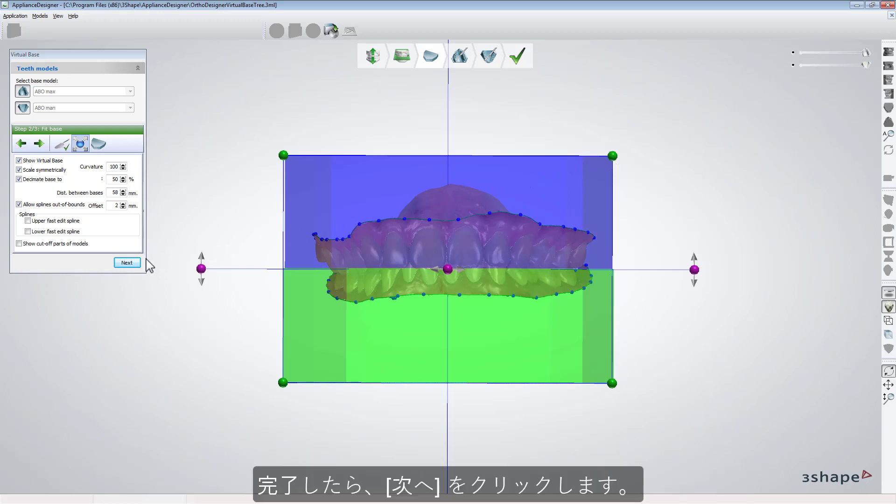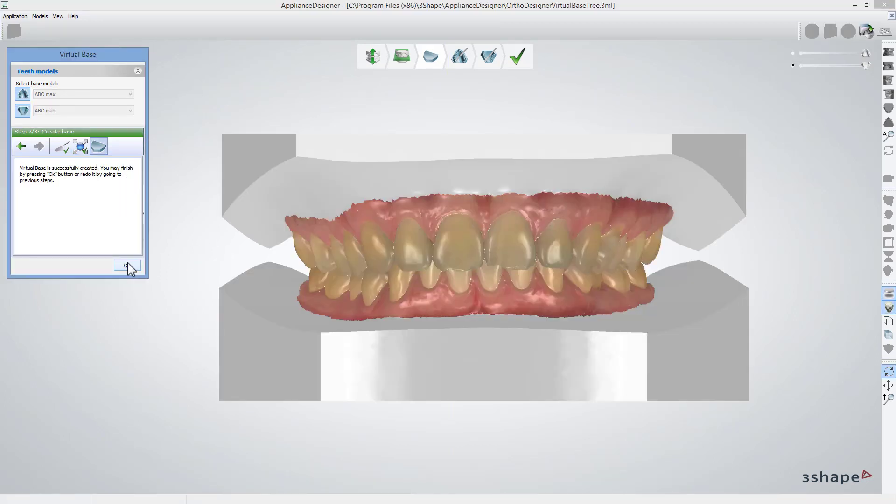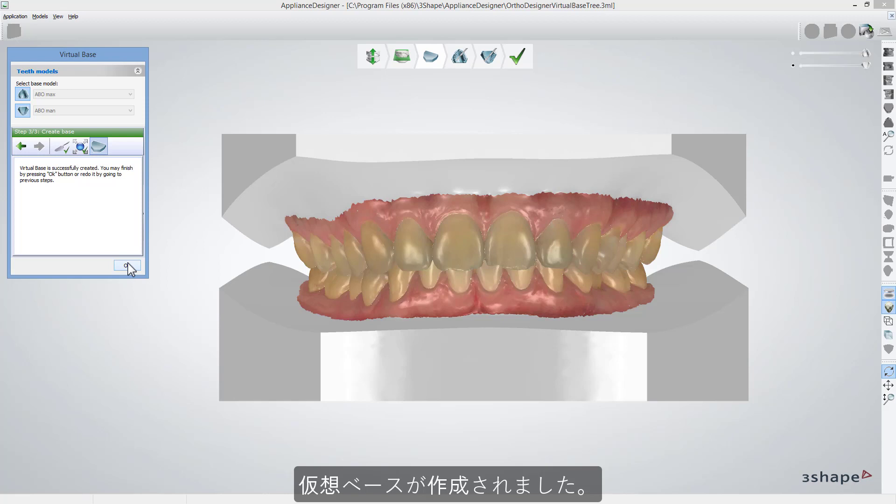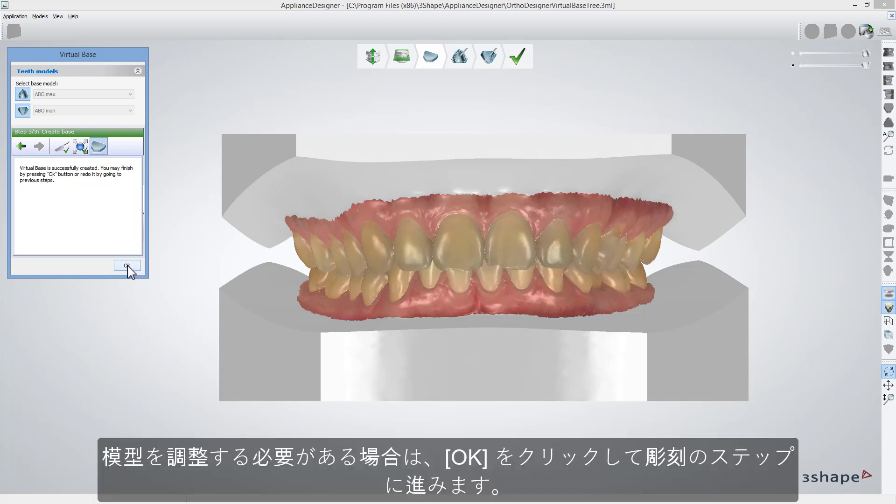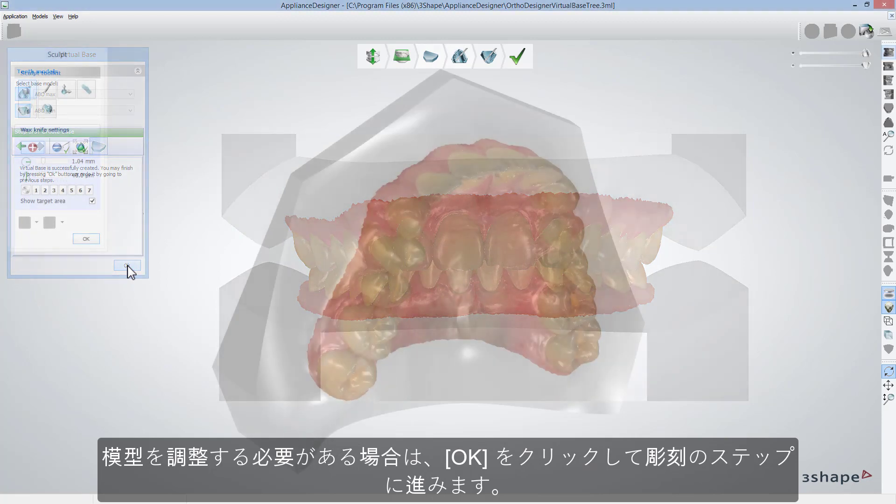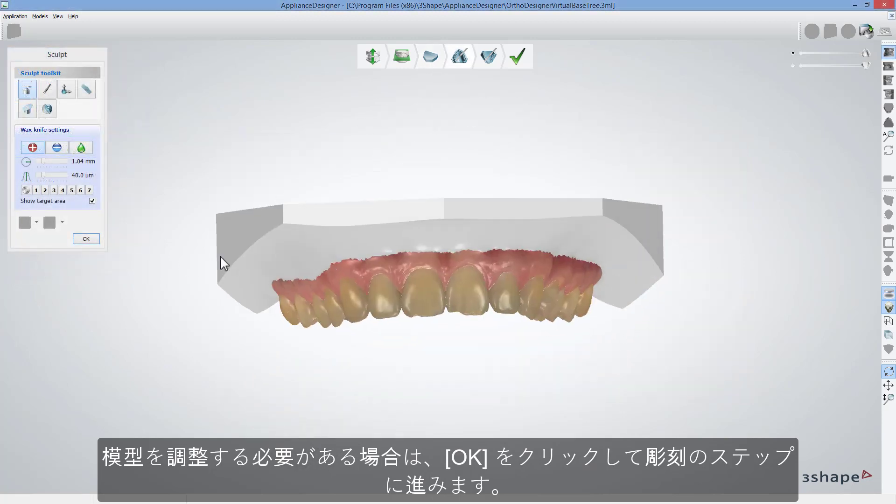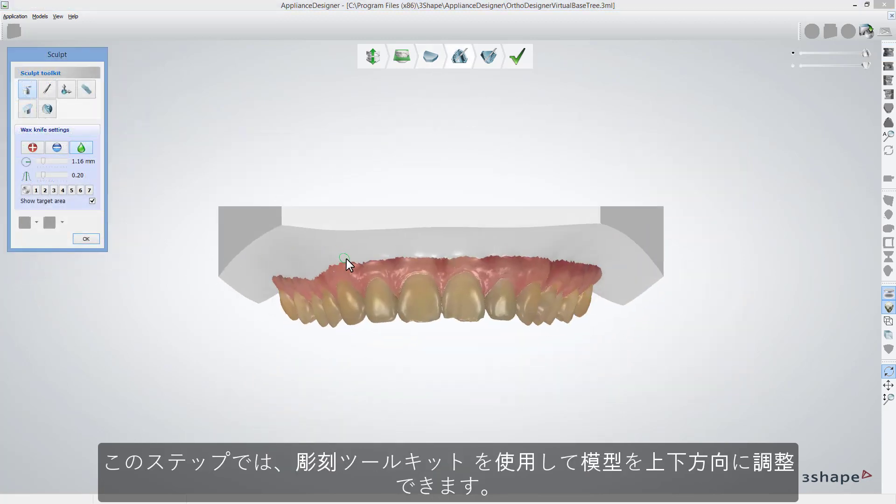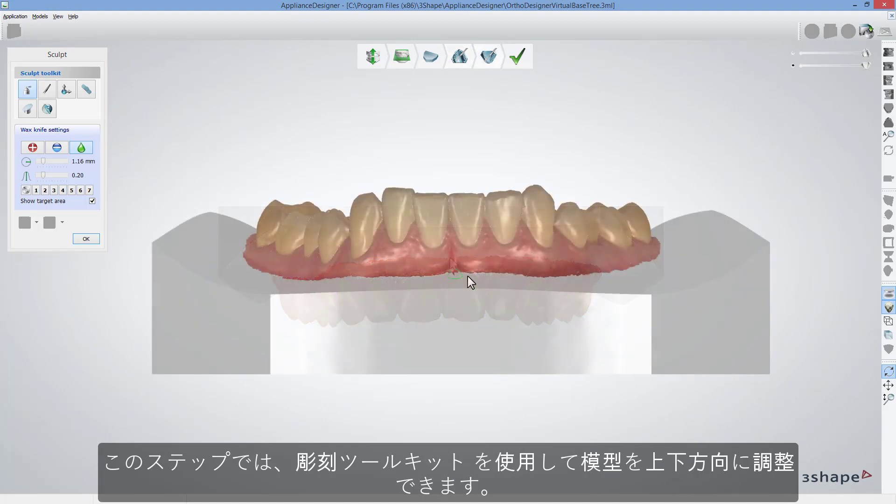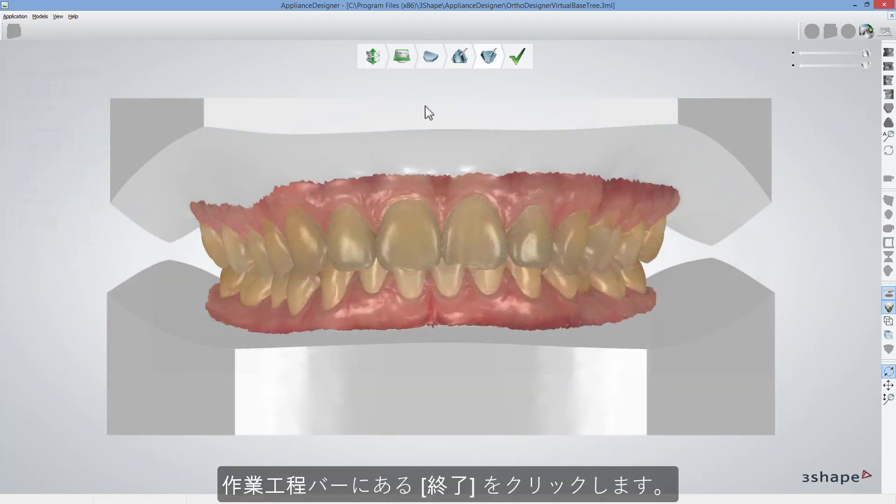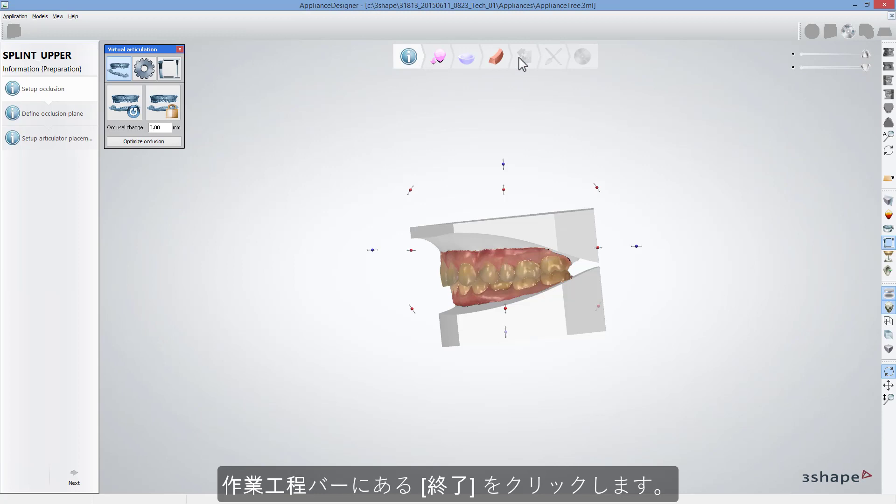You need enough space to fit in all CAD scans. When done, click Next. The software creates a virtual base. If you need to adjust the models, click OK to get to the Sculpt step where you can adjust the models, upper and lower respectively using Sculpt Toolkit. When you are done, click Finish on the workflow bar.